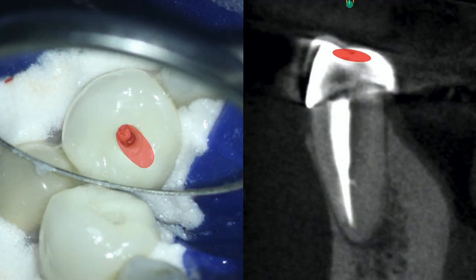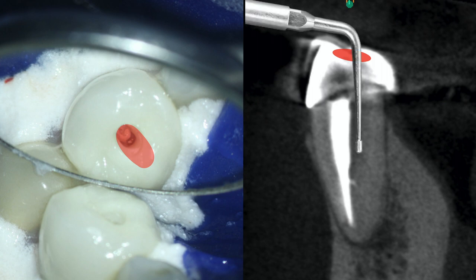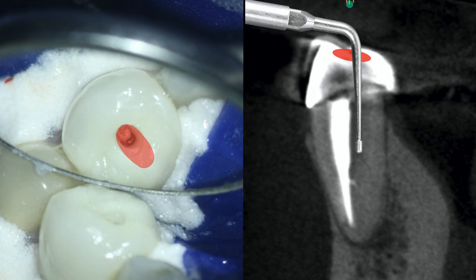One strategy I generally see from clinicians learning to treat deep bifidities is the troughing strategy. This involves extending the access to the lingual, measuring the target vertical depth, and using an ultrasonic instrument advanced apically to the target vertical depth of about 11.5 millimeters. However, this can be very aggressive and unpredictable because it relies on the clinician to maintain precision orientation freehand to very deep levels. That's very difficult and comes with high perforation risk, high misdirection risk, and high ledge formation risk — too many risks. There's a much more conservative way: treating this lingual canal through the buccal canal.